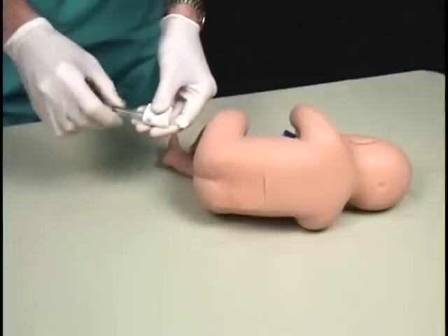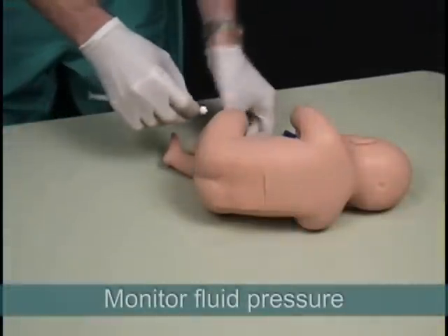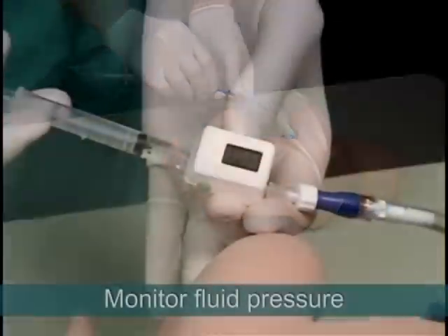An optional pressure gauge can be added to one or both of the lines to more precisely measure and control the fluid pressure.